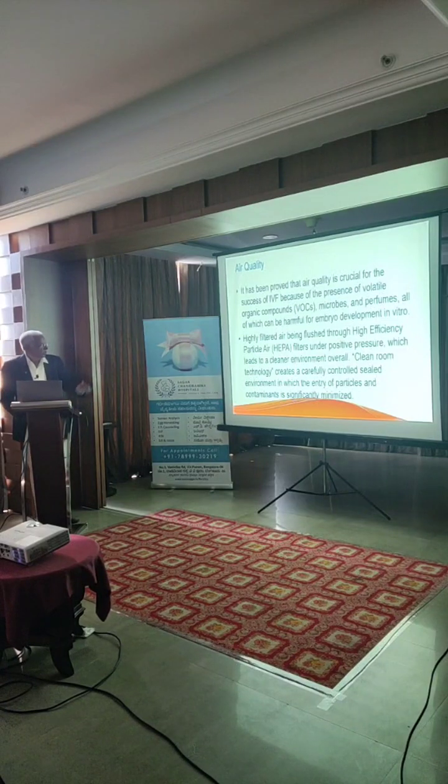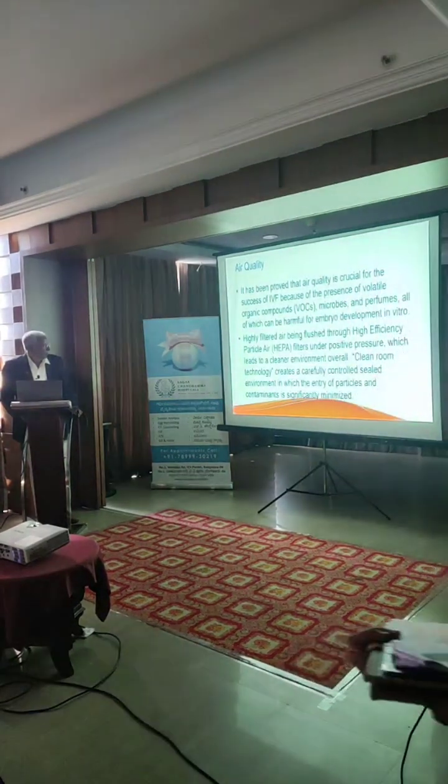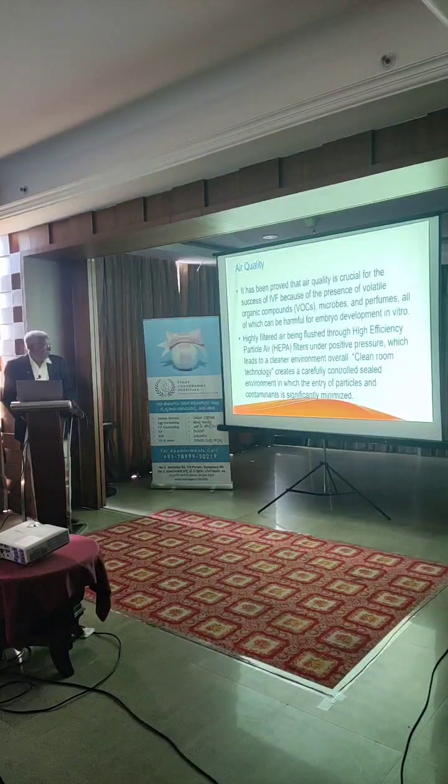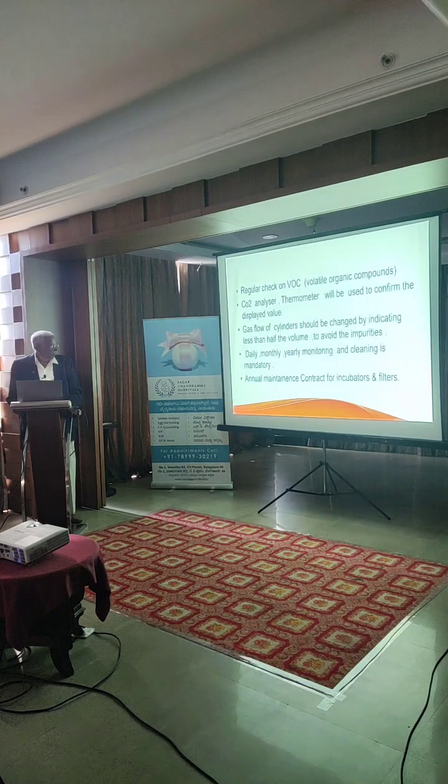As I said, the air quality, we should not have any fumes, micro perfumes, all that cannot be used inside the laboratory. And the high efficiency filters, both clean room as well as the laminar flow, have to be checked properly. And one thing I would like to say to you, when you buy any of this equipment, you should go to a proper person who will supply these instruments, and unless you do that, you will not get proper results.